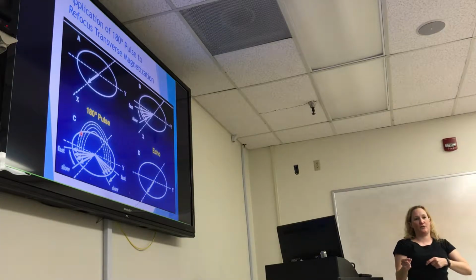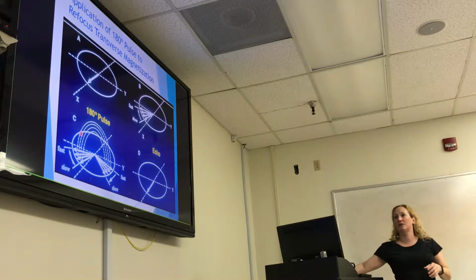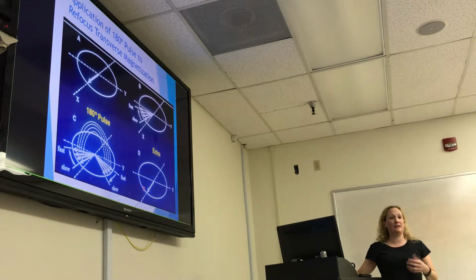And again, the fast ones now can catch up with the ones that were slow and got behind, and then they all come together in our lovely spin echo. And that's kind of right there in the name. It's spinning, right? And there's an echo, it's a spin echo.